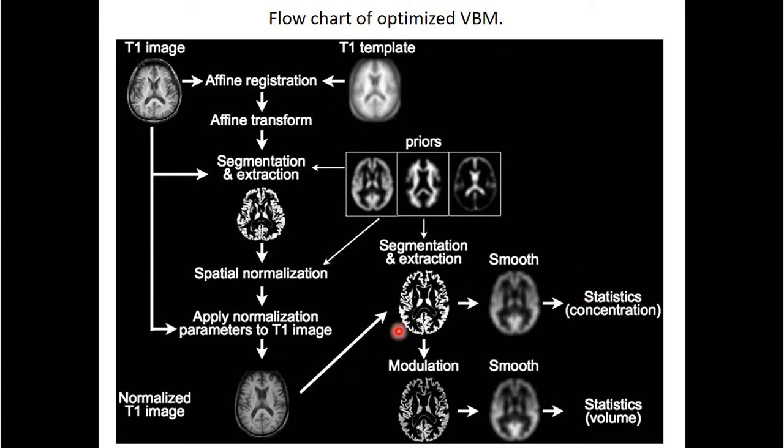This is what you can see here. So this is the template. This is an optimized and updated version of this toolbox, which will not run today. It's just to give you a frightening overview of how complex the task is here.